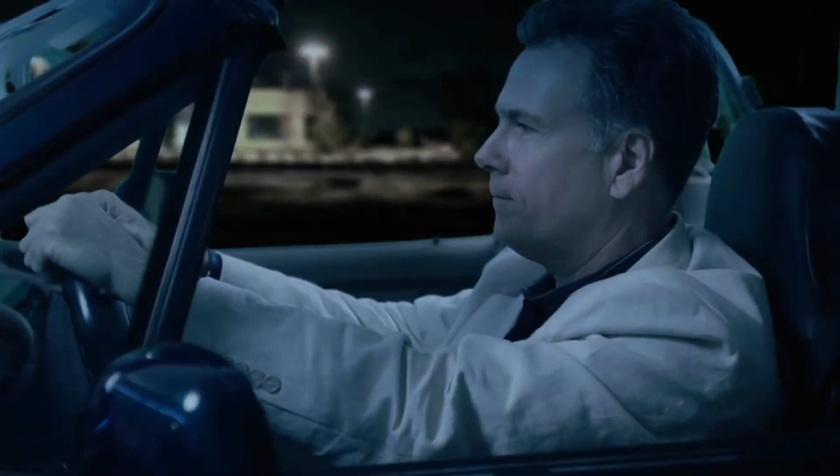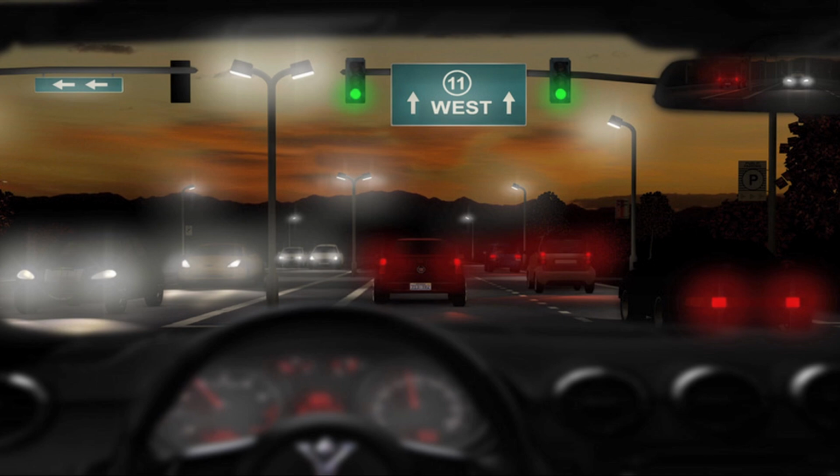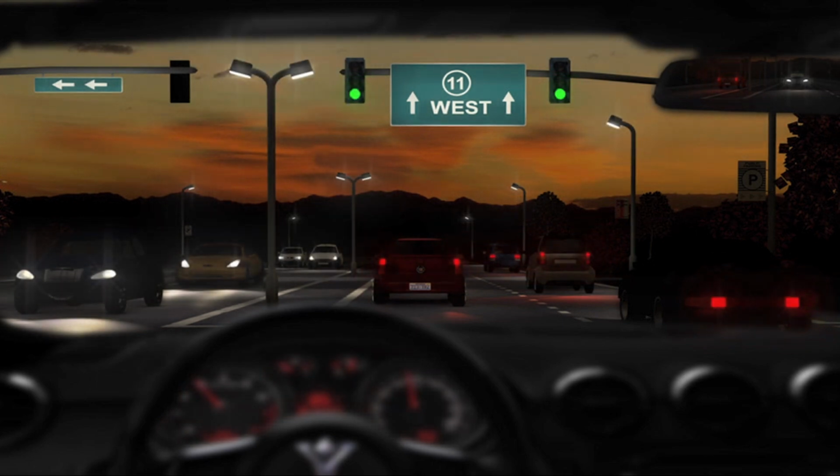Should you choose to have a multifocal or extended depth of focus IOL, you will most likely notice glare and halos around lights, especially at night. Most patients report these visual side effects diminish in intensity over time as the brain adjusts to the multifocal or depth of focus lens. But these visual side effects may not go away completely.